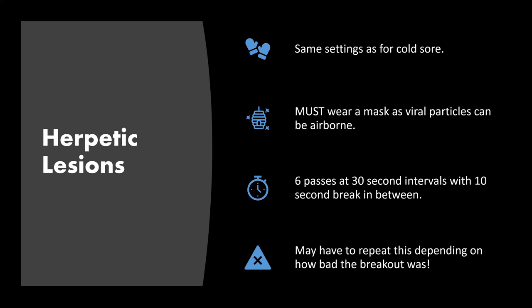And just hang out there for 30 seconds. Then stop and do it again. Start near there and go a little closer, and do that for 5 or 6 passes until you can almost touch the lesion. Then the person is going to feel immediately better and likely won't bother you again.